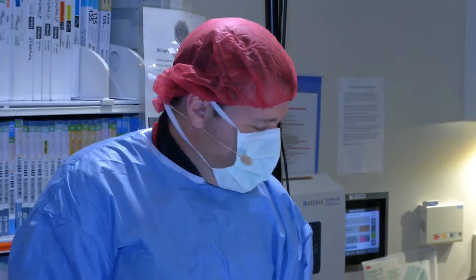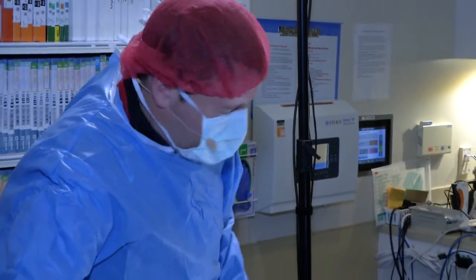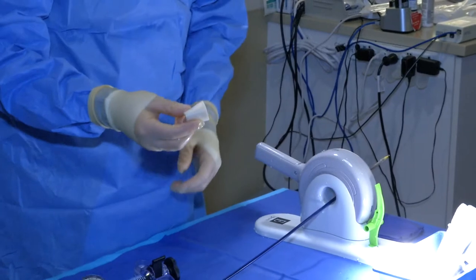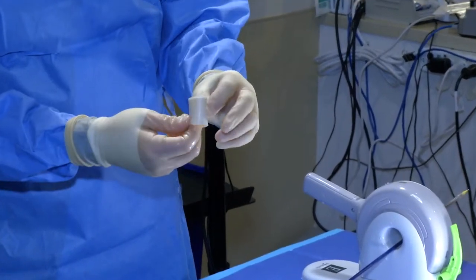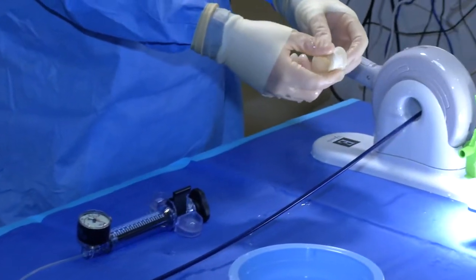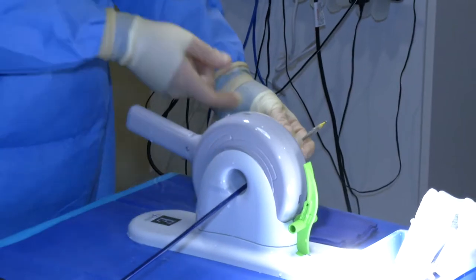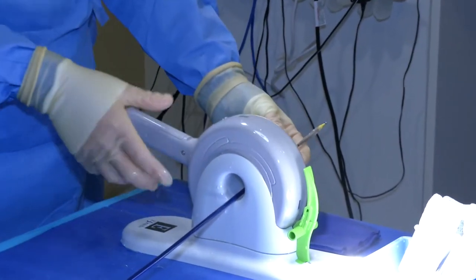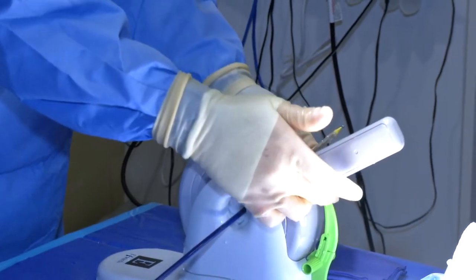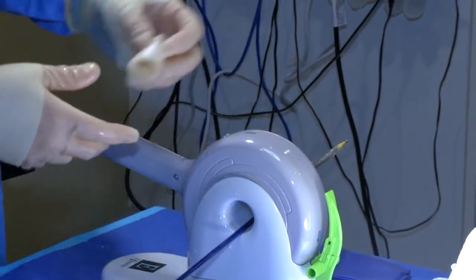So here we have the valve now. What I did, and you guys off camera, we had a crimp stopper here that was on here. And I had the valve inserted inside this Qual-Crimp, or it's just a foam cover device that helps protect the valve as it gets crimped. So I just placed the valve right on the tip of the catheter. And then I crimped all the way down over the valve until it hit this green crimp stopper. And so that was the first crimp.